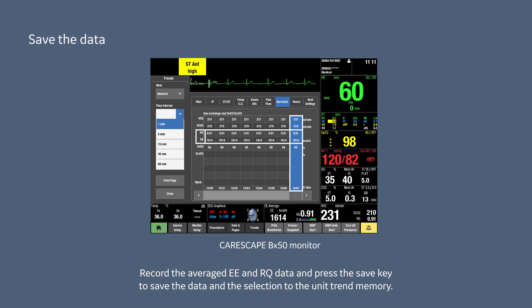Record the averaged EE and RQ data and press the save key to save the data and the selection to the unit trend memory.